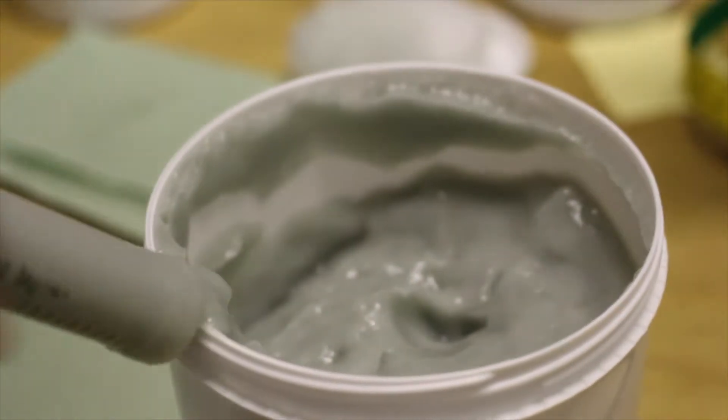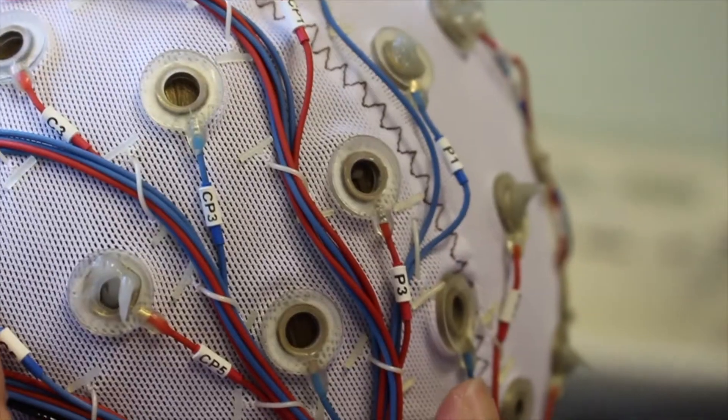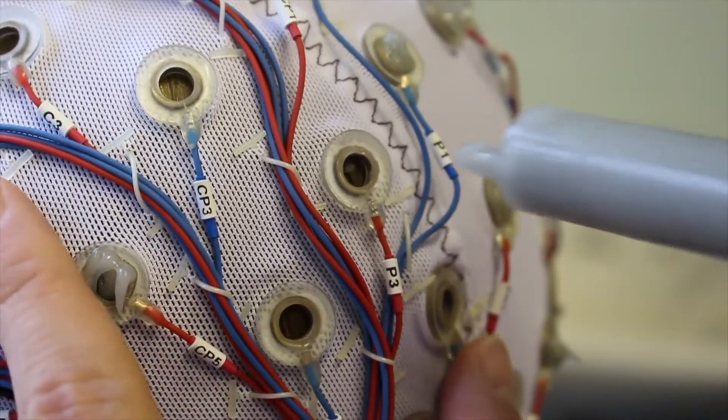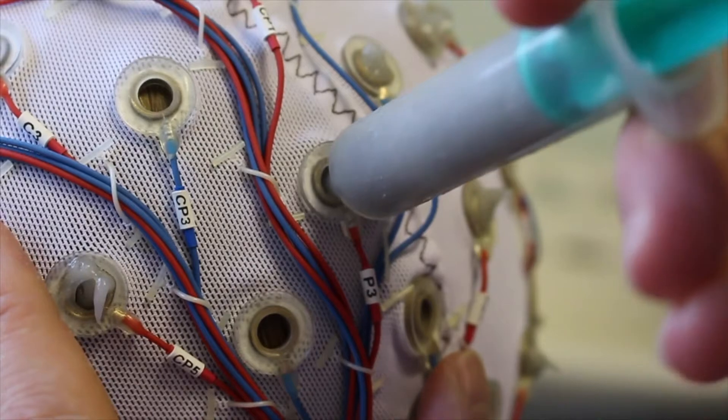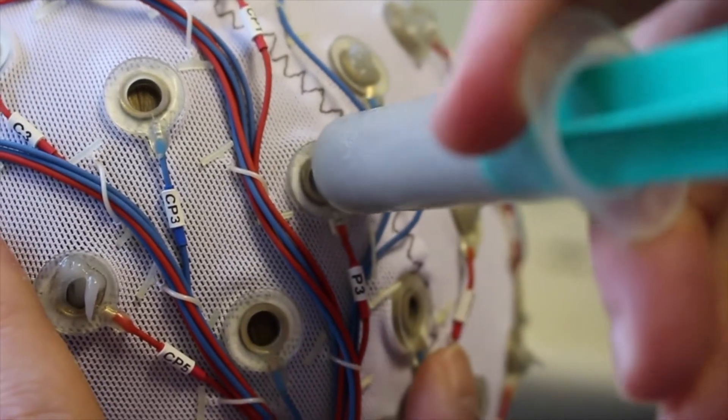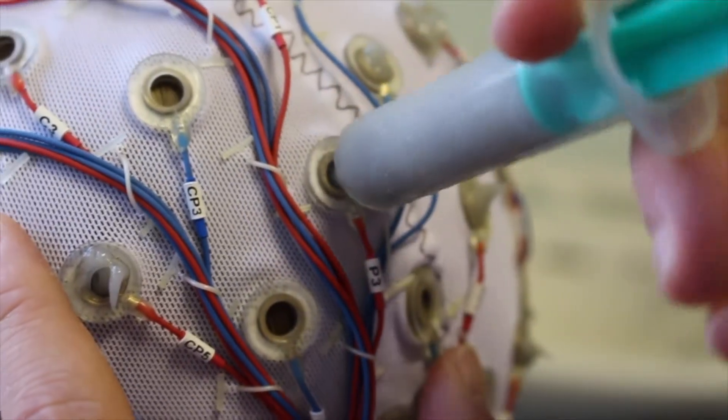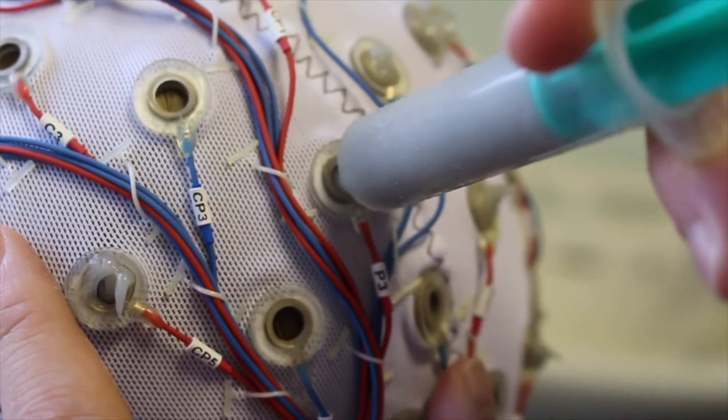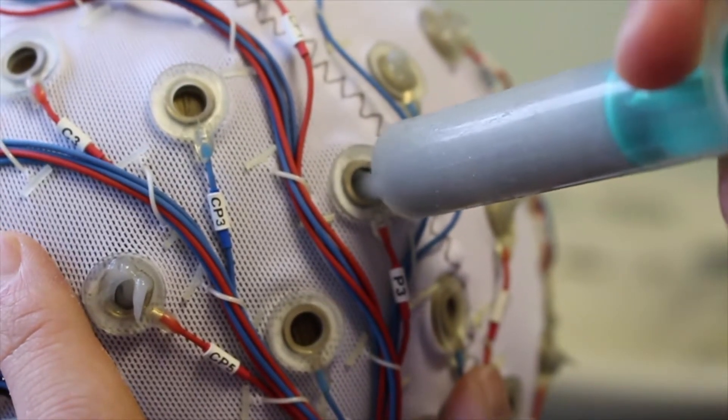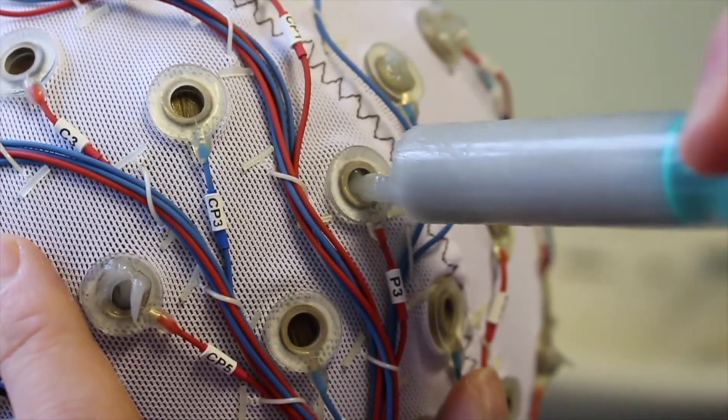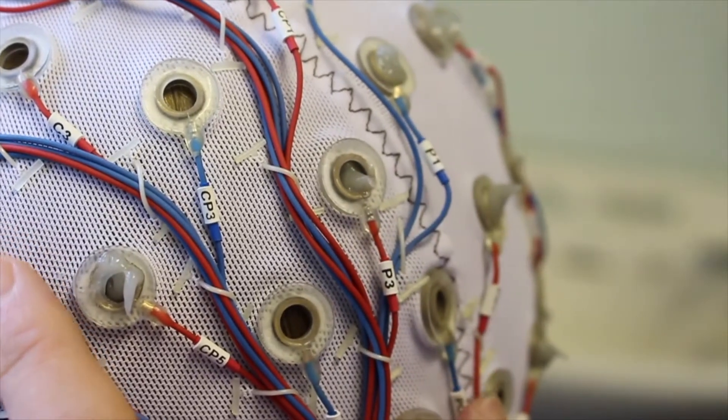First, place a towel over the participant's shoulders to avoid getting any gel onto their clothes. Once done, gently insert the syringe into an electrode using the tip to part the hair out of the way and help you reach the scalp. Carefully squeeze out some gel while slowly pulling the syringe back out. Your aim is to create a bridge between the electrode and the scalp.